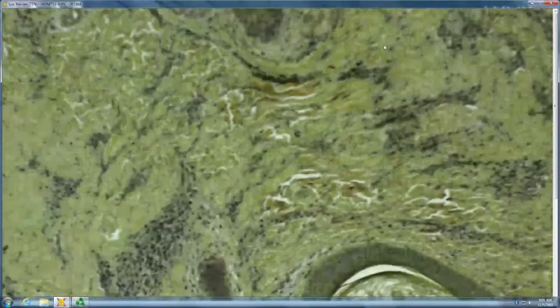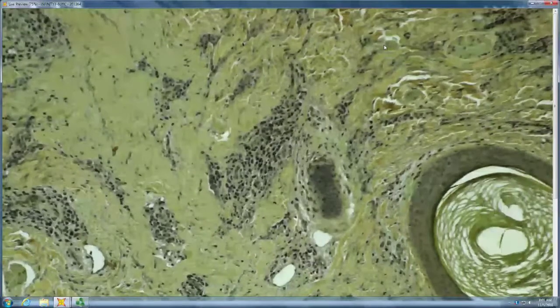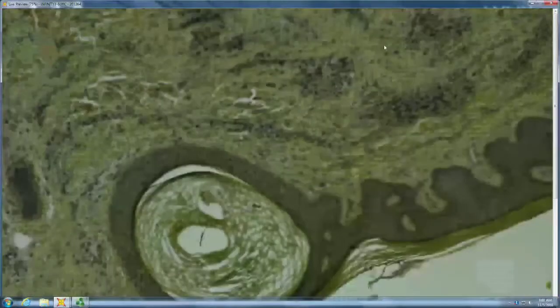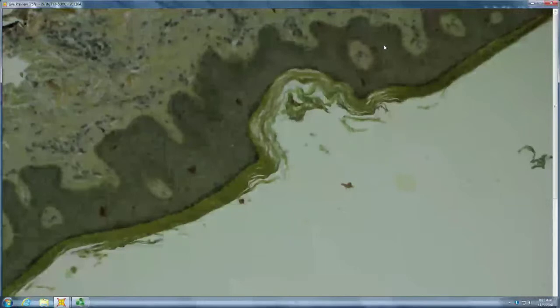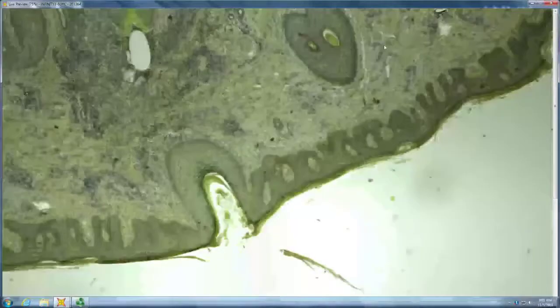Is it ending deep or ending high? Ending high, right? And you've got some recoil of elastic fibers next to it. And you've got not only follicular dilatation, but they kind of stick up a little bit, like maybe you had a spine there. You can make it out here in this one. So what's going to give you this pattern? LPP. Yeah. So that's lichen planopilaris. Well done.